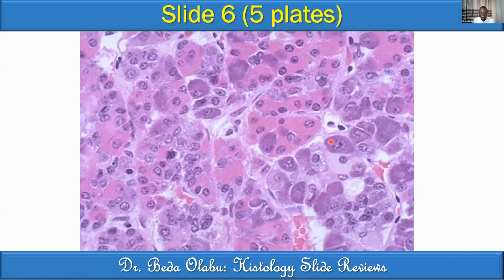Apart from those parenchymal cell types, we also have supporting cells of the anterior pituitary. The supporting cells of the anterior pituitary are termed the folliculostellate cells. They'll tend to be in the connective tissue framework, like those ones, folliculostellate cells, or these ones, folliculostellate cells.